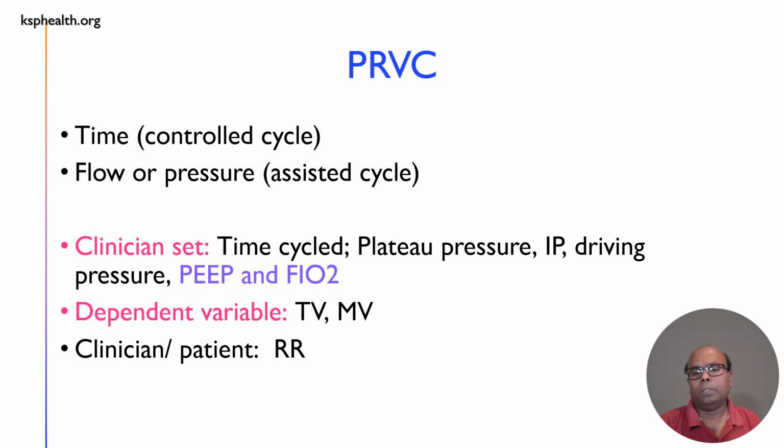Another addition is pressure regulated volume control. I want to dispel one thing. This is not a volume control mode. It is a pressure regulated mode. Time controlled.